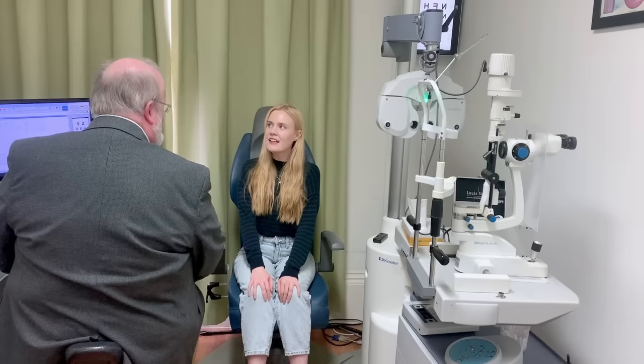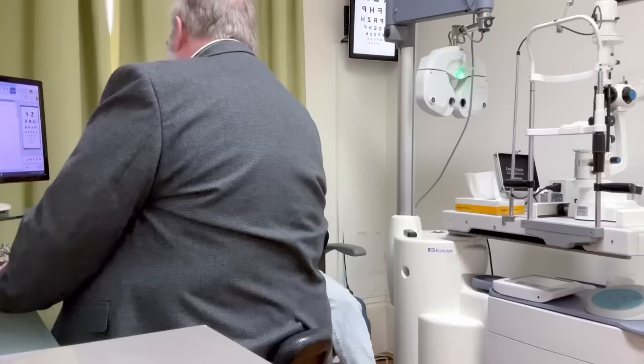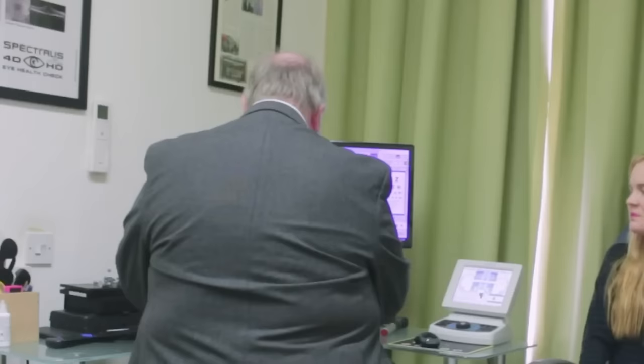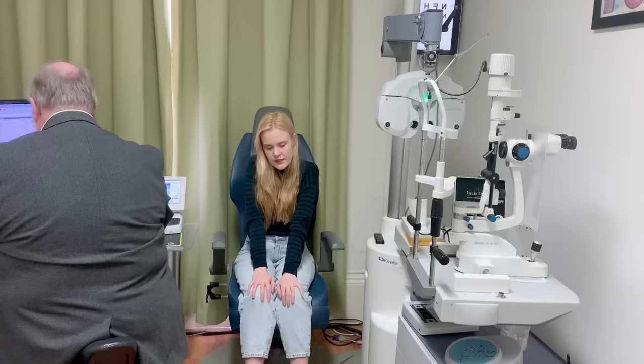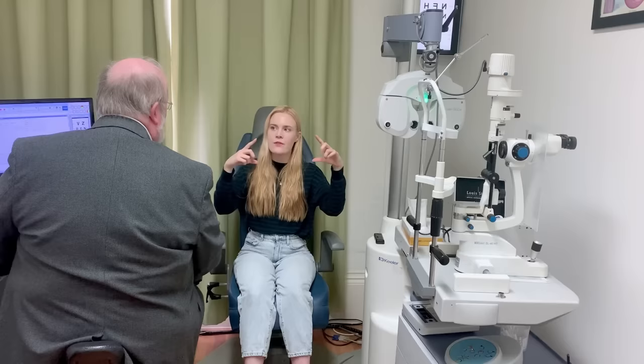I definitely need to wear my glasses when I'm watching television. Okay, yeah. So you're using it for mainly distance, are you? Mainly distance, yeah. How's reading close work, things like that? Reading, if it's on an actual, like, physical book, I'm fine. Also fine if I'm, like, on my phone, like, really close. Okay, yeah. But on a computer screen, sometimes I get a bit of eye strain if I don't wear them. Don't wear your specs, yeah.